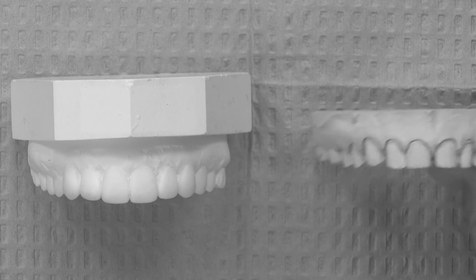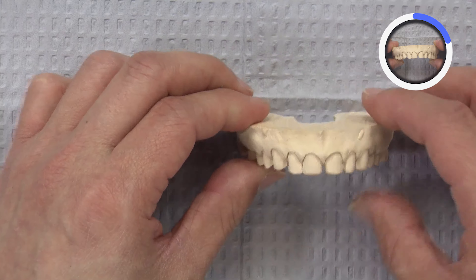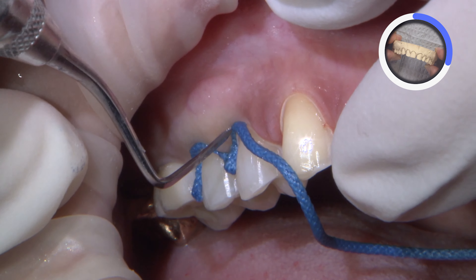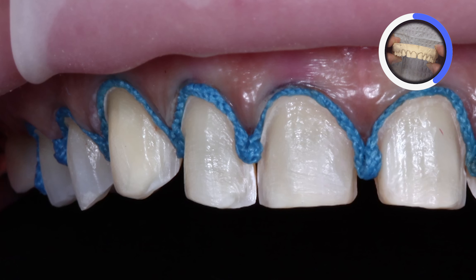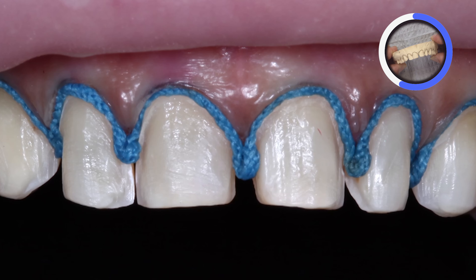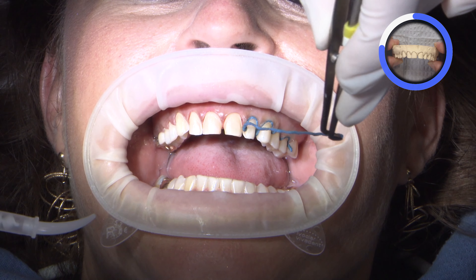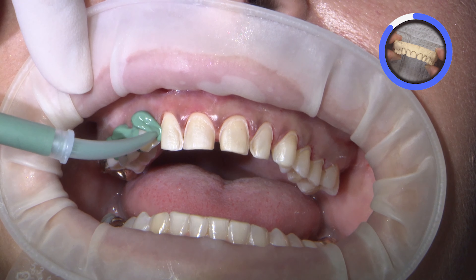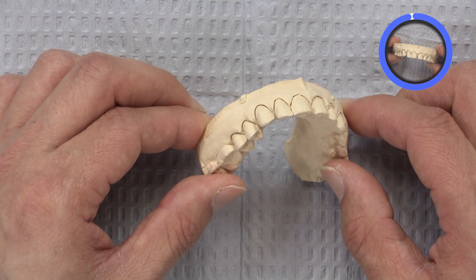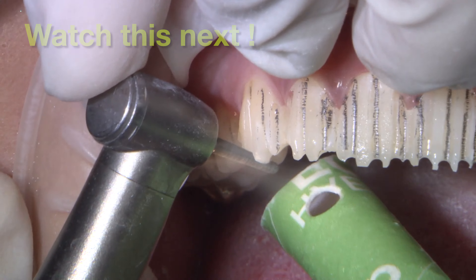For the actual preparation, this is what the finals look like. With just a single cord — as you'll see on the clinical video — a single size-one cord was used to create enough retraction. All of the margins were brought right to the free gingival margins on each of the teeth. The single size-one cord helped displace the tissues apically and also pushed the tissues out laterally, allowing the light-body PVS material to flow into the sulcus and achieve that separation. Once the depth cuts were marked, I switched to a larger 850-018 burr to expedite the finishing of the preparations.